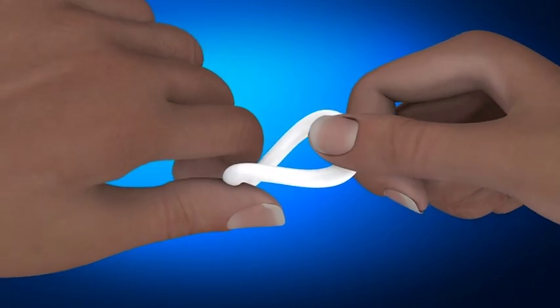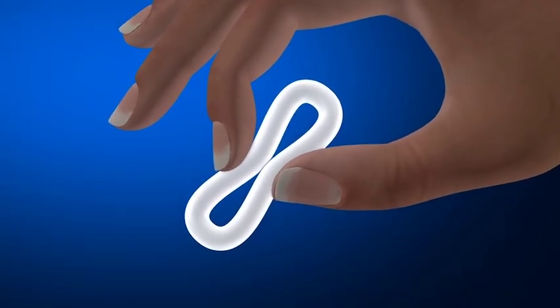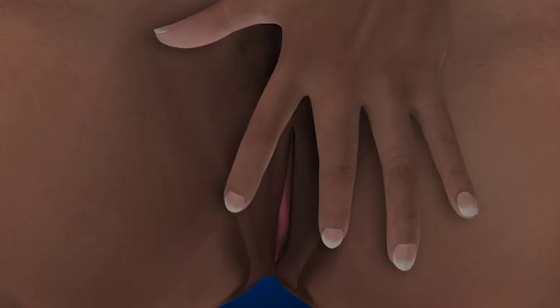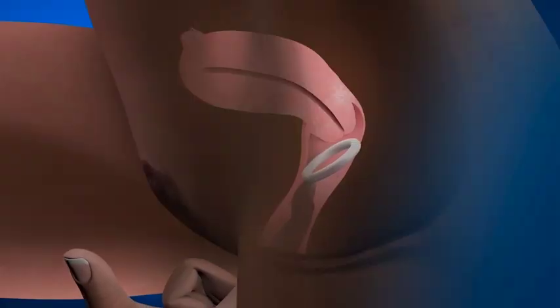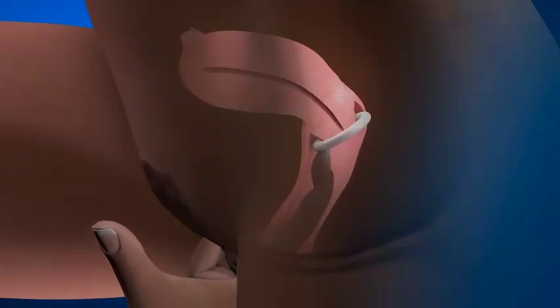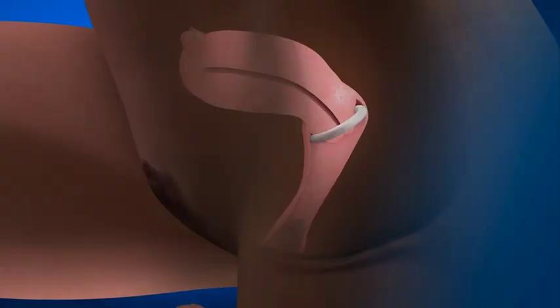To insert the ring, squeeze it into a number 8 shape, or squeeze the sides of the ring together. Using your other hand, hold open the folds of the skin around your vagina. Place the tip of the ring into the opening of your vagina, then use your index finger to gently push the folded ring in. Push the ring into your vagina as far as you can.